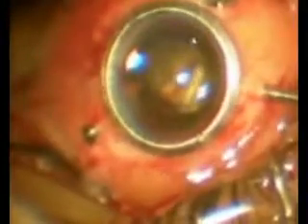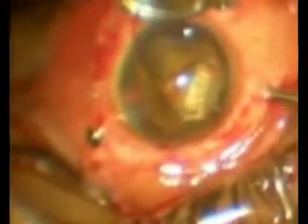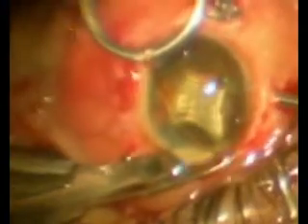So now it was decided to hold the foreign body forceps in the right hand, and it was put in through the sclerotomy. The foreign body was then grasped with the forceps and lifted up and brought into the anterior chamber. The ring was removed and a limbal incision was then made and enlarged with the corneal scissors. The foreign body was firmly held with the right hand in the forceps.